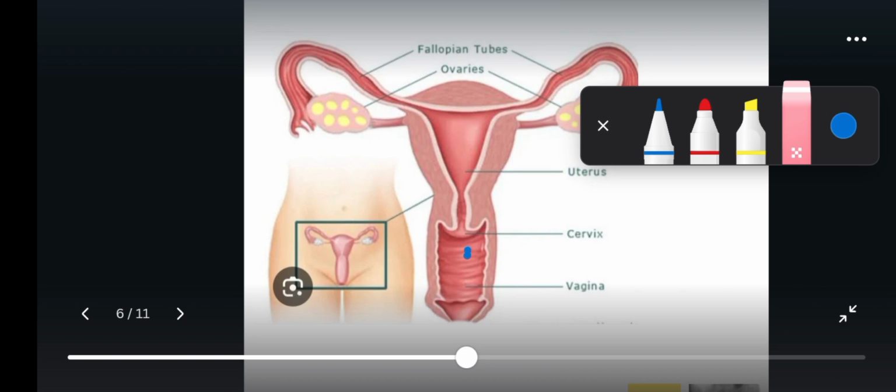During this injection, the patient feels mild to moderate pain depending on the state of the tube. If the tube is closed, the patient tends to feel more pain during the injection because it is forcing of the fluid against resistance.